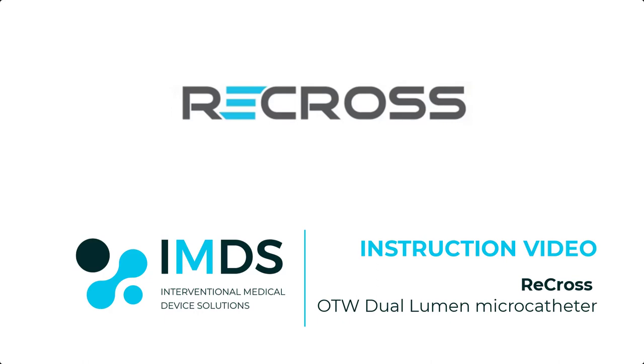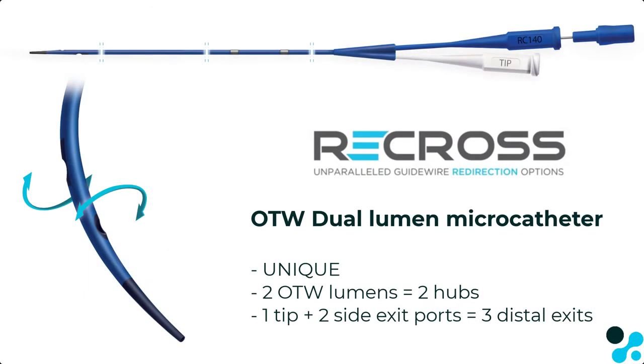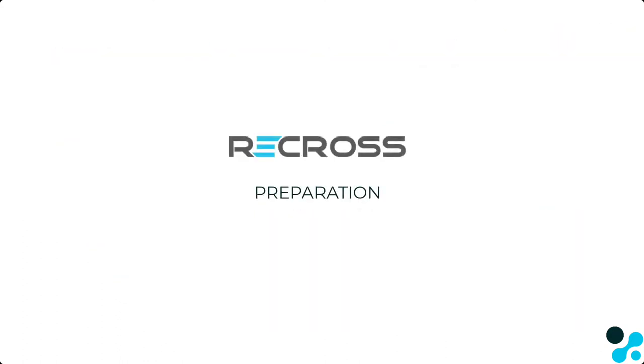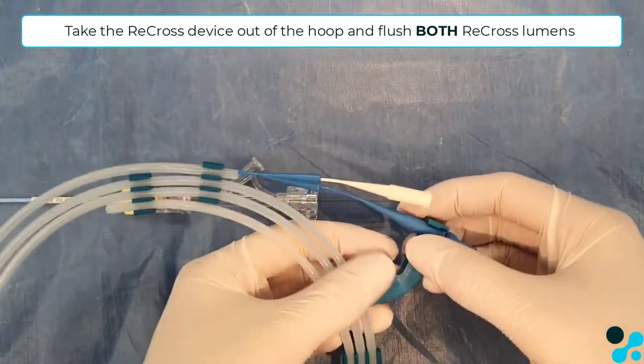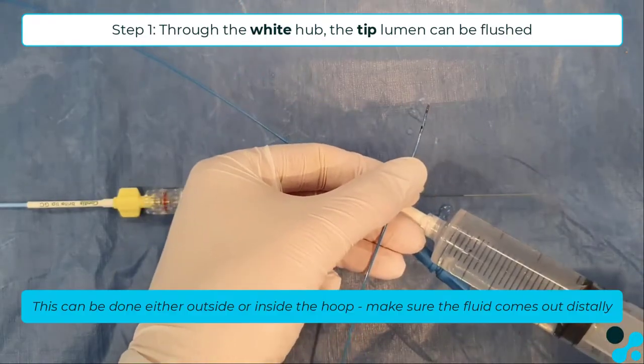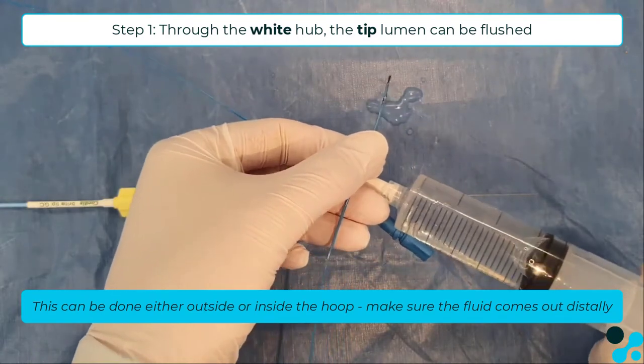In this instruction video we will show you how to use the unique Recross over-the-wire dual lumen microcatheter with three distal exits. The device can be taken out of the hoop and should be flushed in both of the over-the-wire lumens. This can be done either inside or outside the hoop.